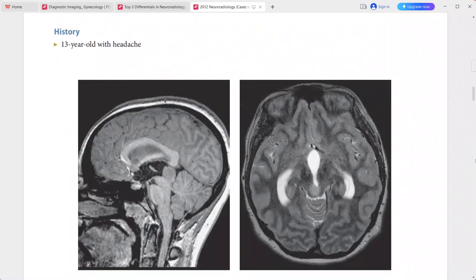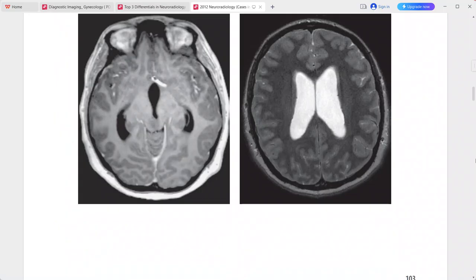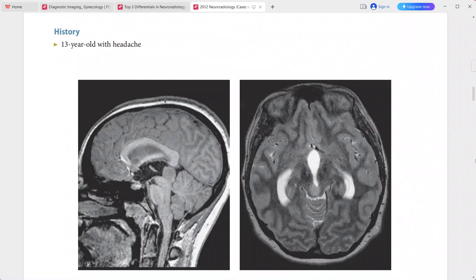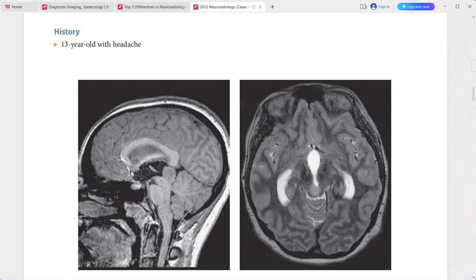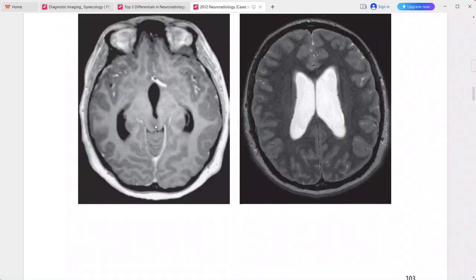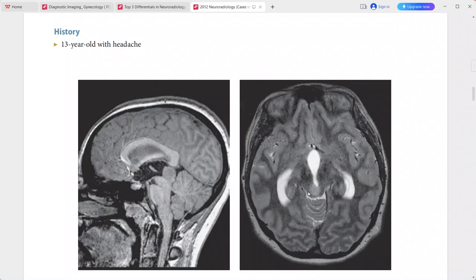Next: a 13-year-old patient presenting with headache. Sagittal T1-weighted MRI shows abnormal expansion of the tectal plate by a rounded mass. The lesion is T2 hyperintense and non-enhancing on post-contrast.